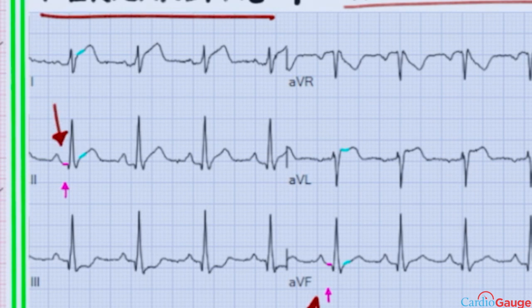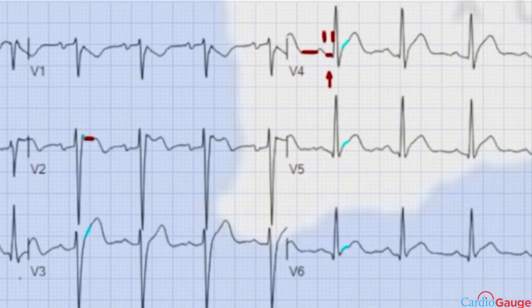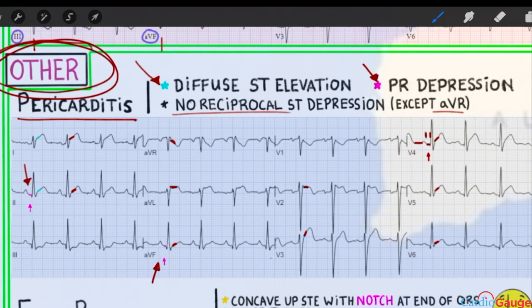And then there's the diffuse ST elevation — one, two, F, L. It's ST depression in AVR because that's in the opposite direction of all the other leads. V2, V3 — there's just ST elevation all over the place. And when it's really diffuse, it makes you think of pericarditis more so than myocardial infarction.